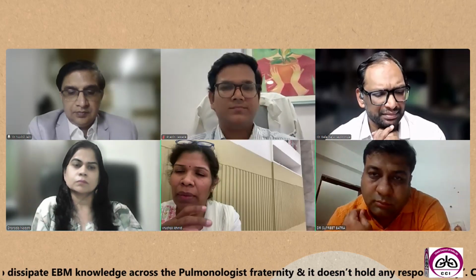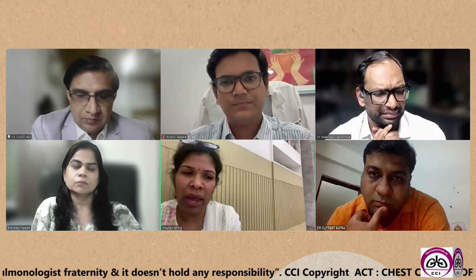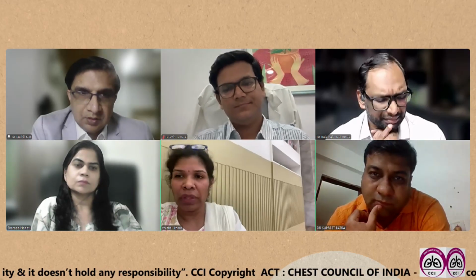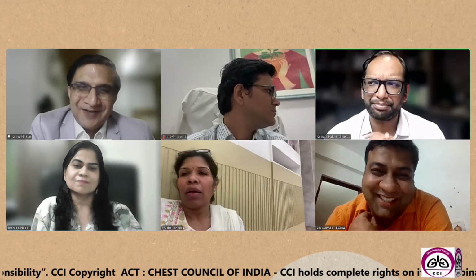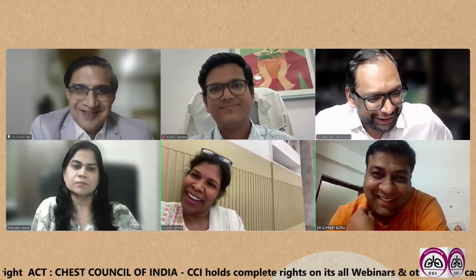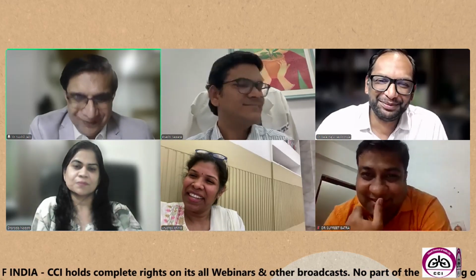They have to maintain themselves from the cortex to the cortex of the other side, and possibly for the necrotic nodes also, going from cortex to cortex can increase the yield, in patients with malignancy, and also teaching this cortex to cortex kind of travel with the needle. Okay. And also, sir, as a learner, you should target bigger nodes and also subcarinal, 7 and 4R. Yeah, 7 and 4R. It is not only for the learners, even the regular people target it. Most of the time, if 7 is enlarged, you take a sample from there and then move on if you have more lymph nodes.